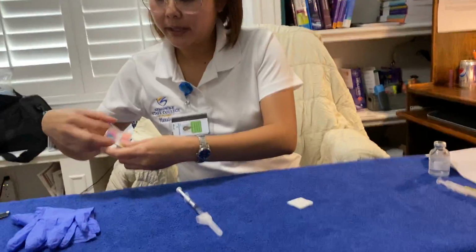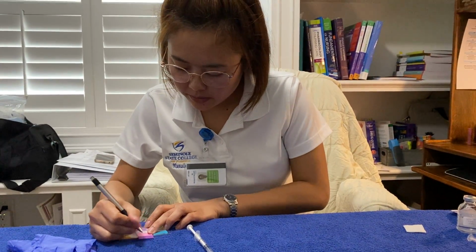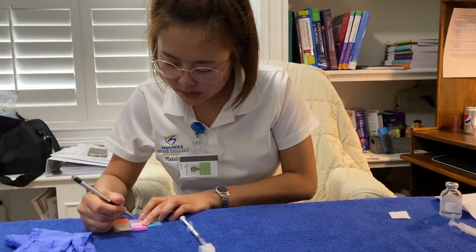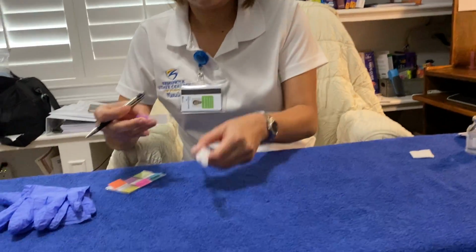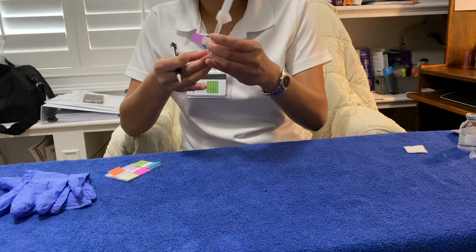So I need to label my syringe. Anna Pulaski, B12, 500 micrograms, 6:15, 2020, and then the time is 4 o'clock, and then my initials.